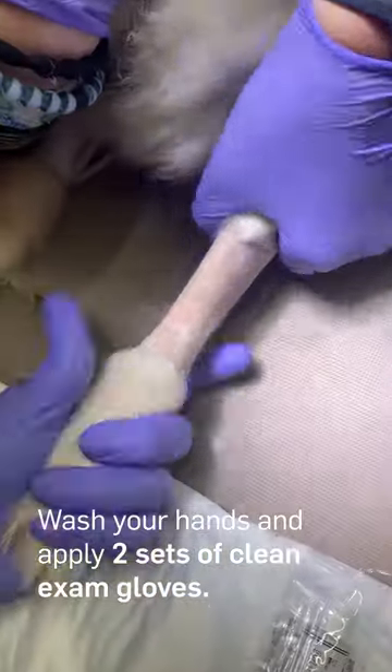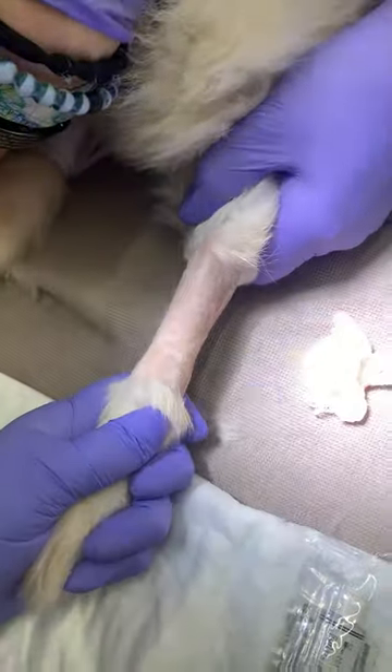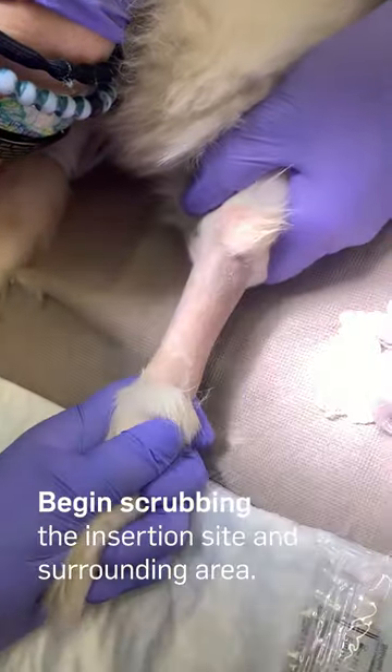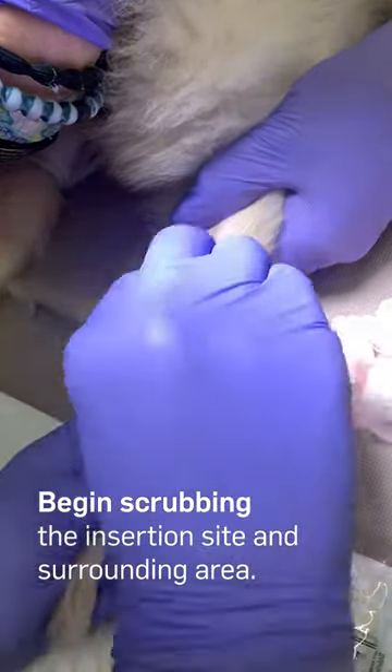Wash your hands and apply two sets of clean exam gloves. Remove any additional fur from the area that may contaminate the site, and begin scrubbing the insertion site first and then the surrounding area.